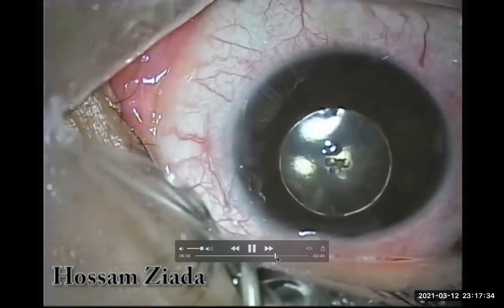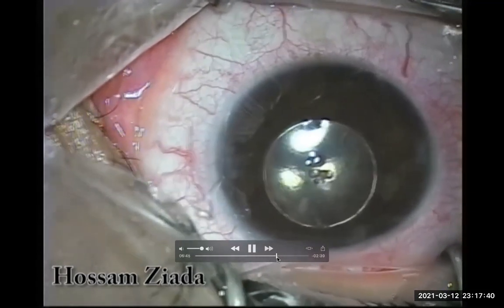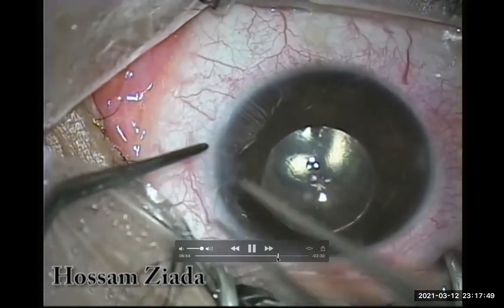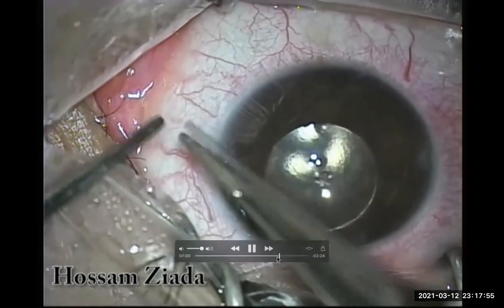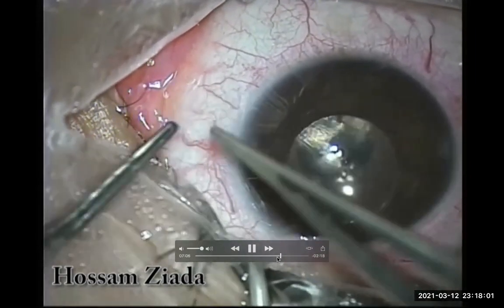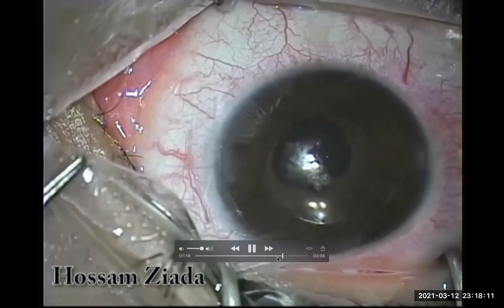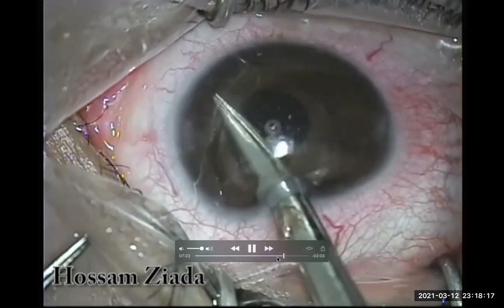This is the circle where I will pass through it — one, two, three, four times, and to be sure you can add a fifth pass. Both sides are stretched together to form a good and strong knot, then the free ends are cut. This completes the one-pass four-throw fixation for the first haptic.